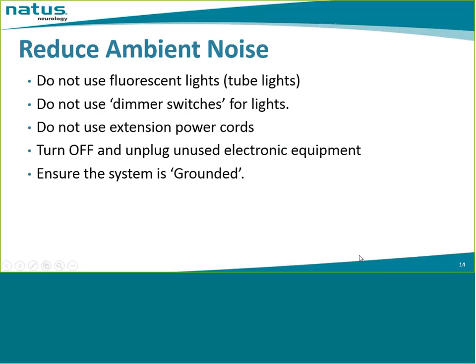And make sure that your system is grounded. This refers to the wall outlet. It has got 3 receptacles. The one at the bottom in some places, which is called the ground, is connected to a metal pole buried outside the building. It is useful for safety, but it is also useful to make sure that we have proper high quality signals. The grounding can be checked by a certified electrician.